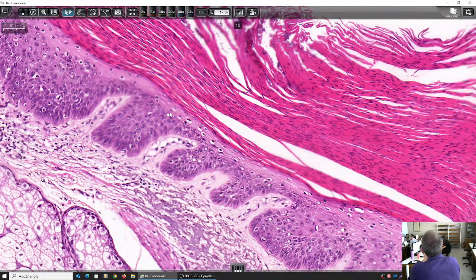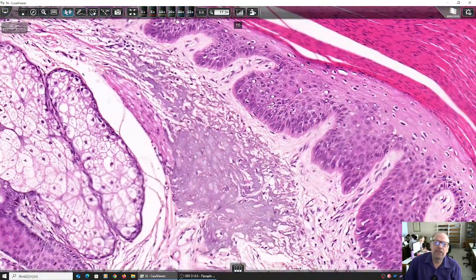So, let's go on. So this is dysplasia, and have a look at the dermis. You see here the dermis? Look, this area of the dermis, this is the papillary dermis, the superficial dermis. Is this area normal? No. This is an elastosis.